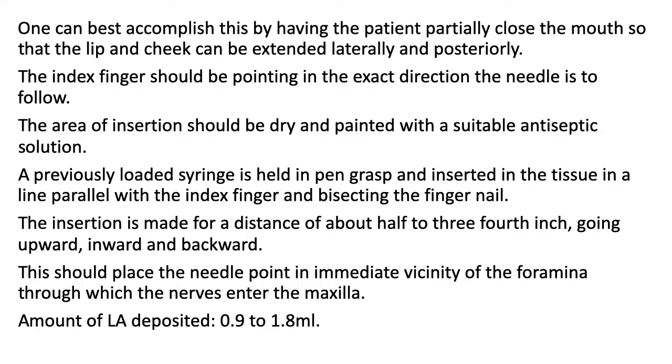This can be best accomplished by having the patient partially close the mouth so that the lip and the cheek can be extended laterally and posteriorly. The index finger should be pointing in the exact direction the needle is to follow. The area of insertion should be dry and painted with a suitable antiseptic solution.